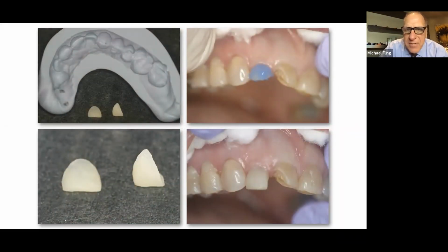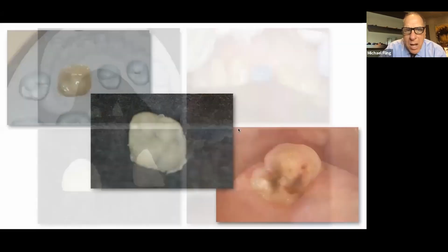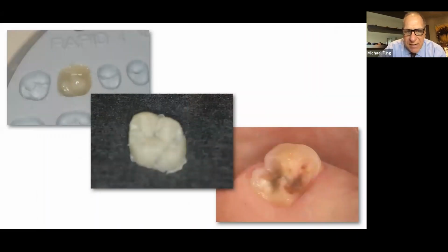I used the same technique. I did a diagnostic wax up. From my wax up, I made a stent. From my stent, I make a thin shell. I trim my shell back until it can passively seat. I etch, I prime, I bond, I put packable composite inside of it.